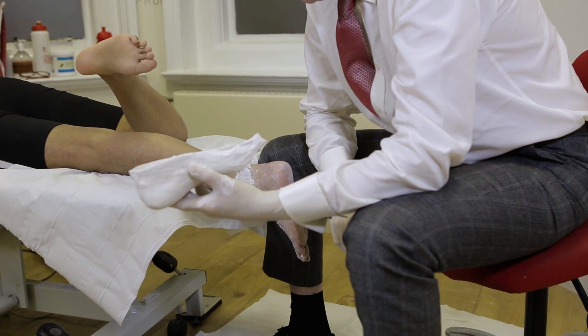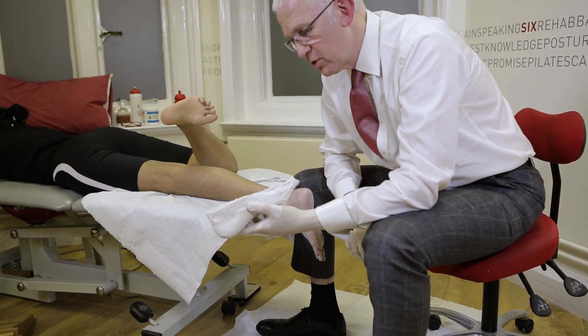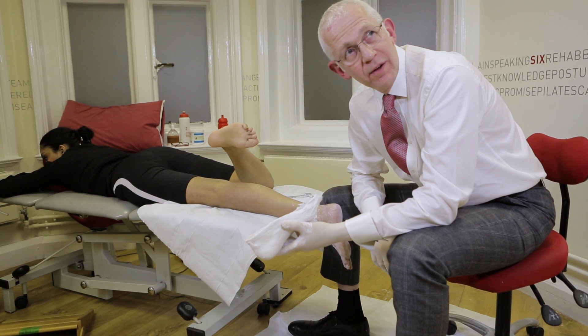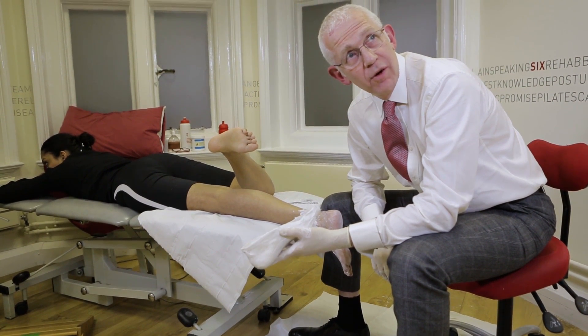Sending these casts away before they're fully dry can be a problem because they'll crush in the box. So what you want to do is either leave them overnight to dry, maybe on a radiator, or stick them in a microwave for 20 seconds — that hardens them up quite nicely. But obviously don't cook your dinner in there afterwards.